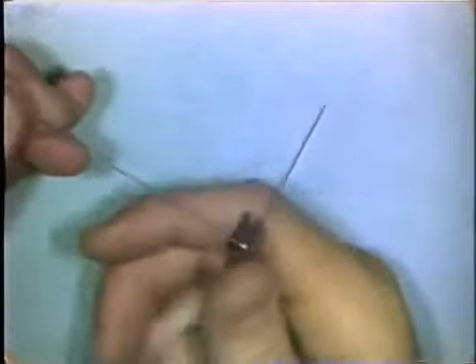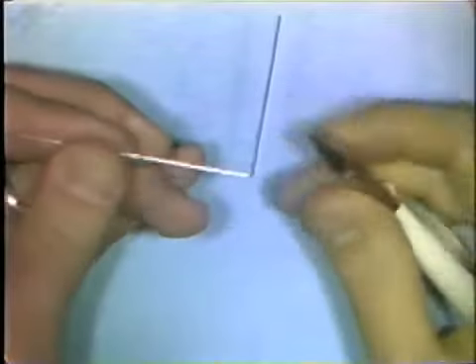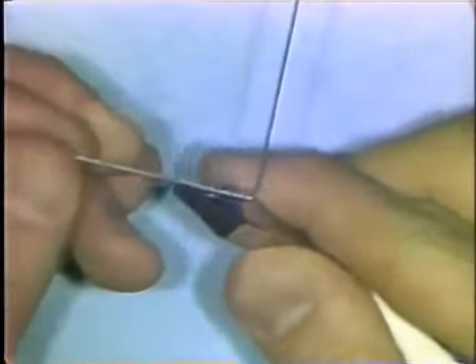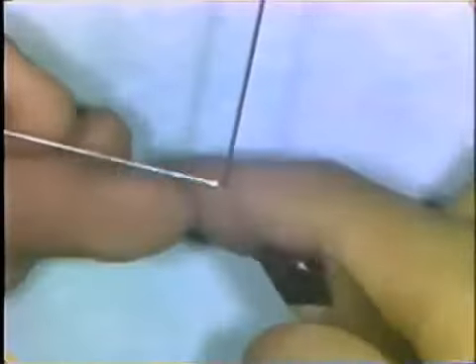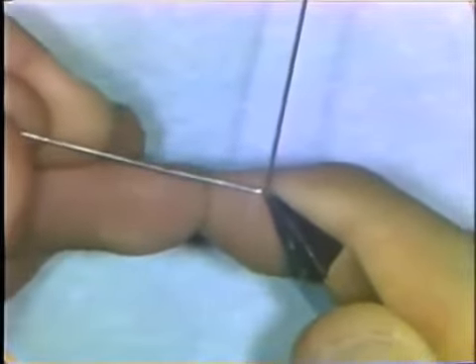The wire for a 90-degree bend, if it's formed properly, should go straight into the bend and straight out of the curve. You want to make sure that the bend itself is confined to a small section of the wire, a small length of the wire.